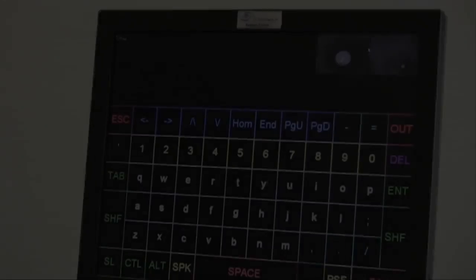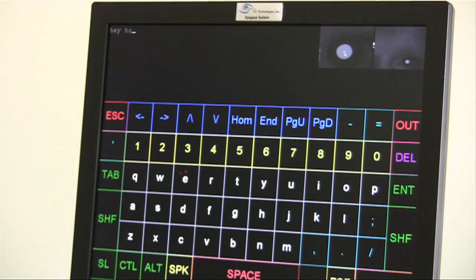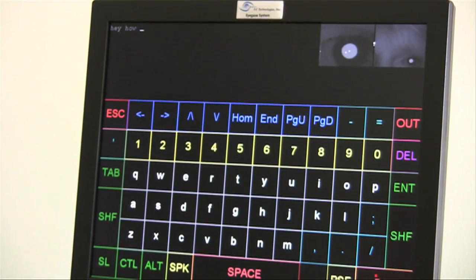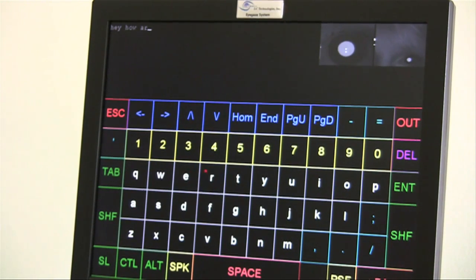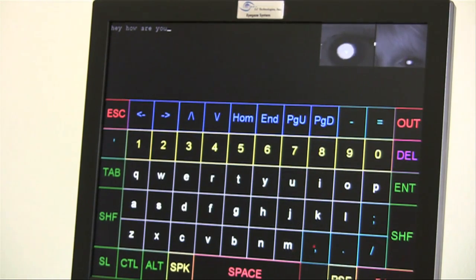Communication system. It is designed for people with complex physical disabilities and is operated entirely with the eyes. By looking at various control keys displayed on a screen, a user can synthesize speech, control his environment, type documents, run computer software, operate a computer mouse, and access the internet.